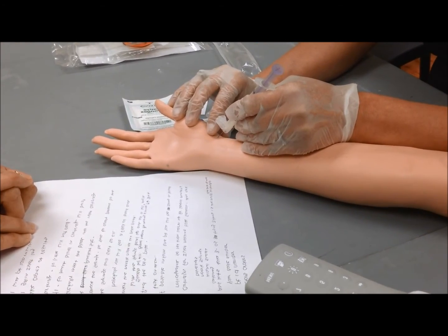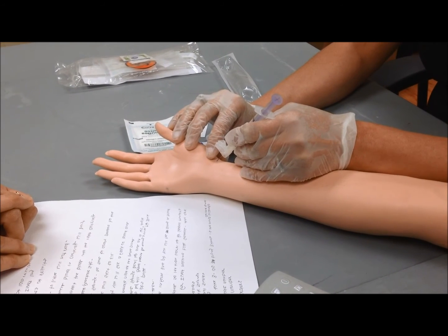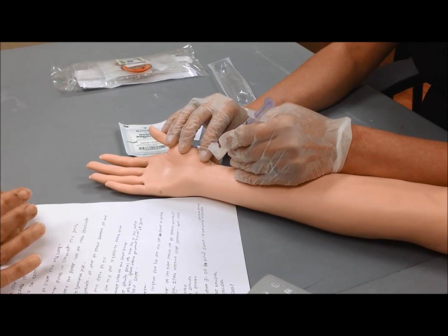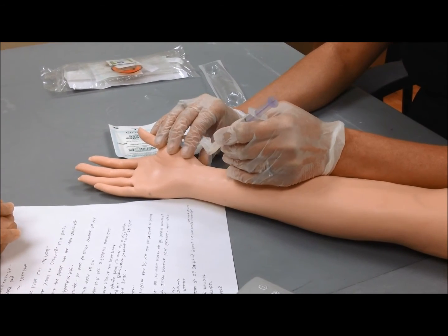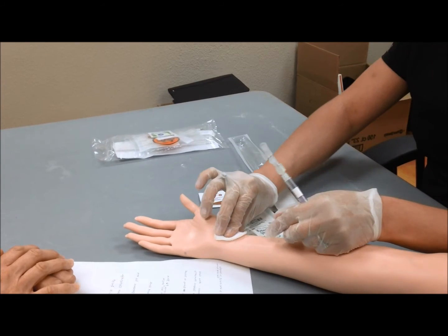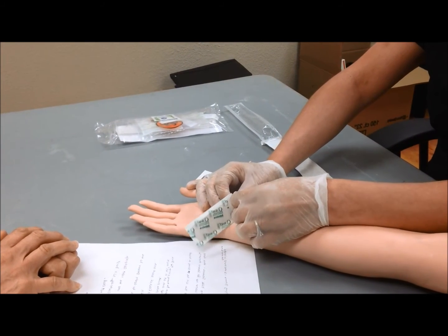You will insert the needle and hopefully you will see a flash. That means you have hit the artery, and the syringe will start to fill. Once you've gotten enough blood, which probably takes maybe a half a cc to a cc, but get as much as you can, because you might need a couple of tries with the cartridge. Remove the needle. Apply pressure to the puncture site. And carefully insert the blood after you've put the Band-Aid on the patient.